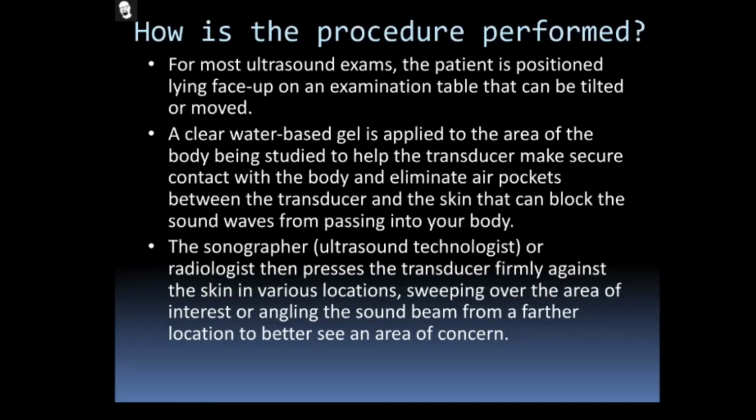Whatever area the sonographer needs to examine, exactly that position will be scanned. You only need to place your probe on the exact region. For example, if you want to examine the kidney or the abdominal region, and you place the probe on the chest, how can it show the abdominal part? That is the very basic thing you need to know about.